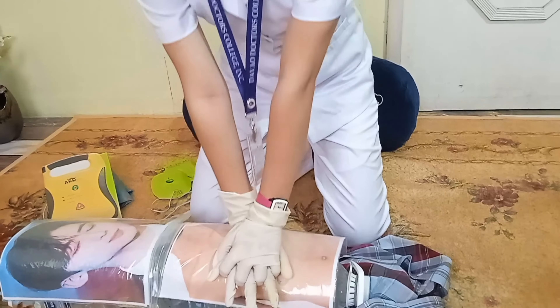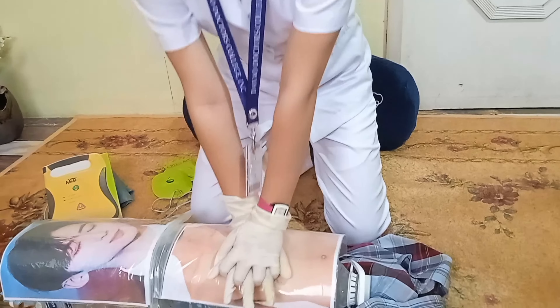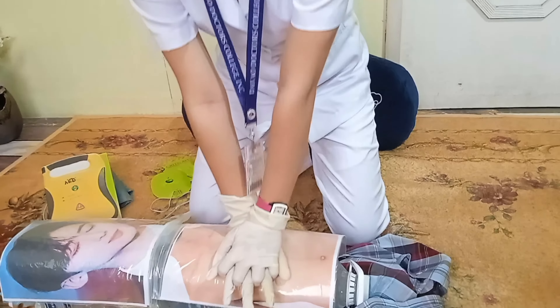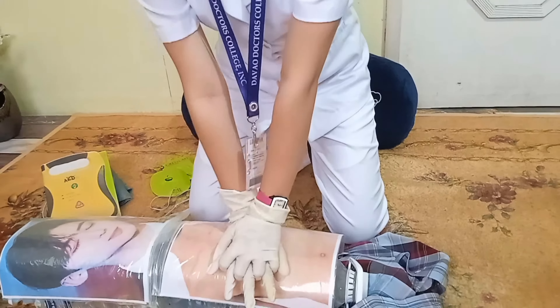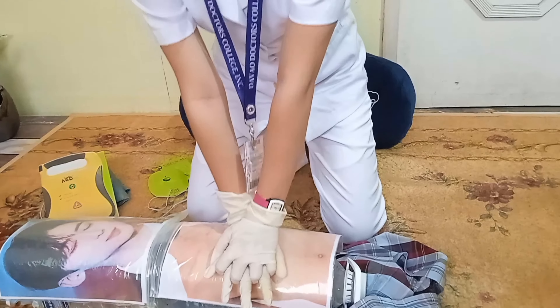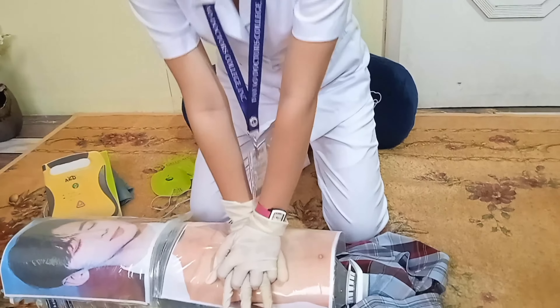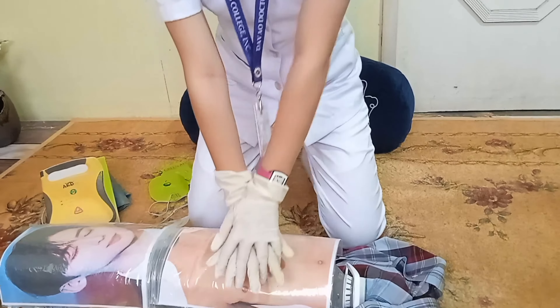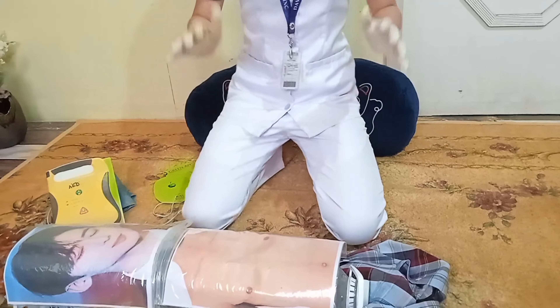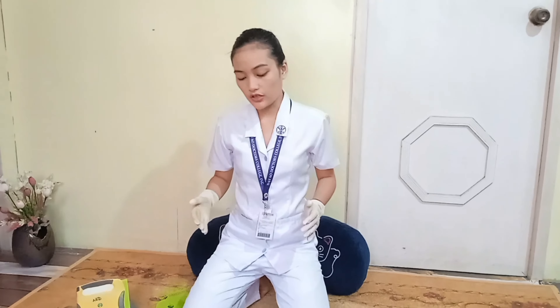Performing 30 chest compressions, counting from 1 to 30. Ensure that there is a complete chest recoil for each compression.